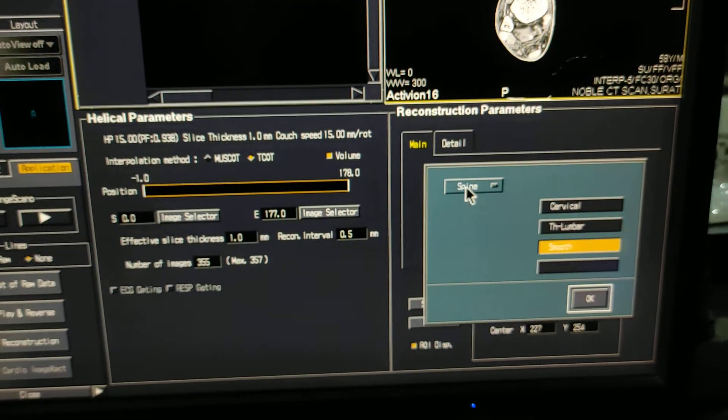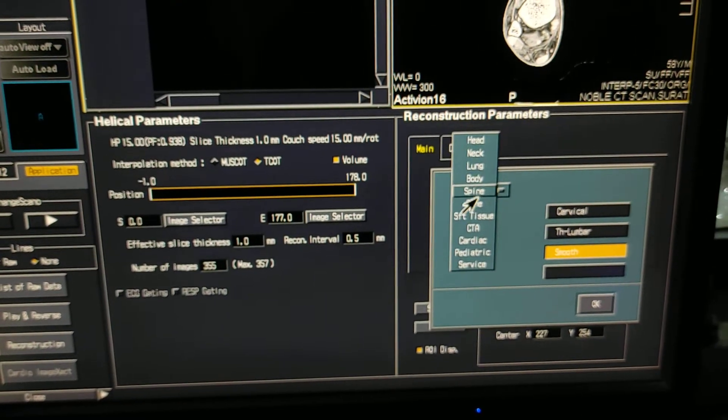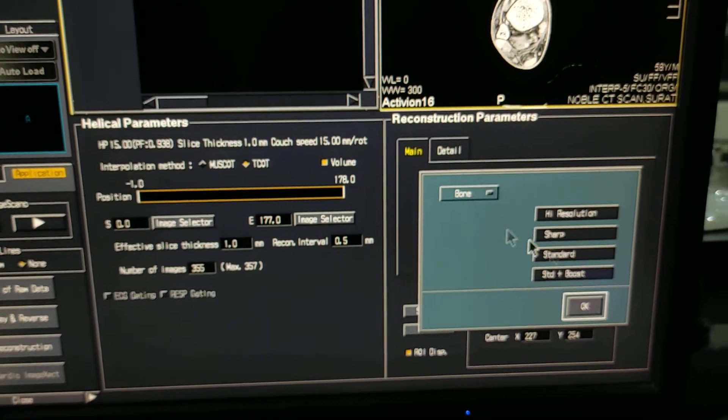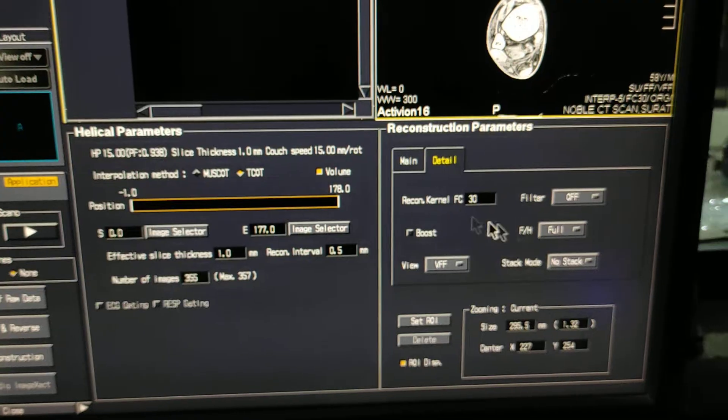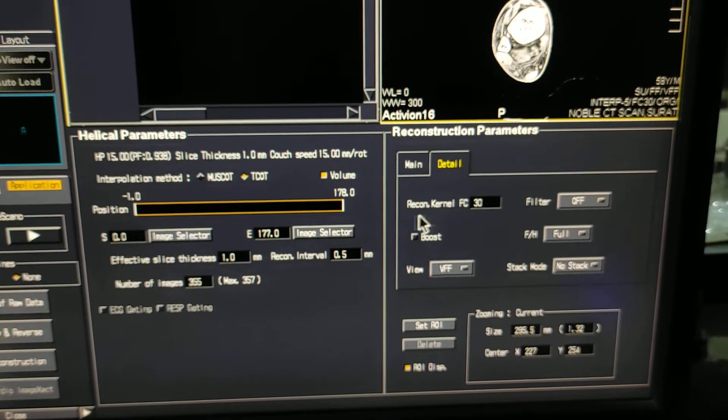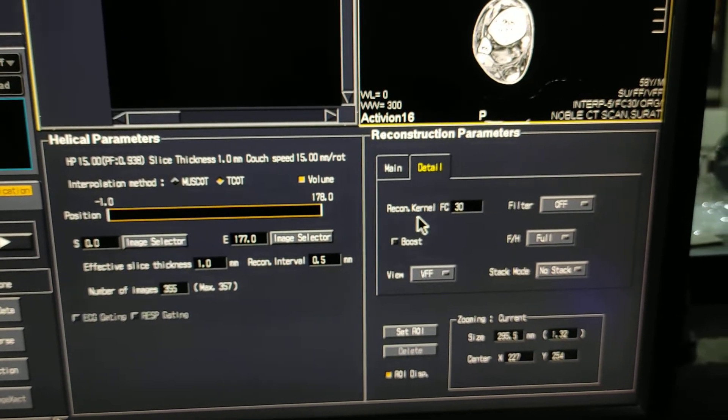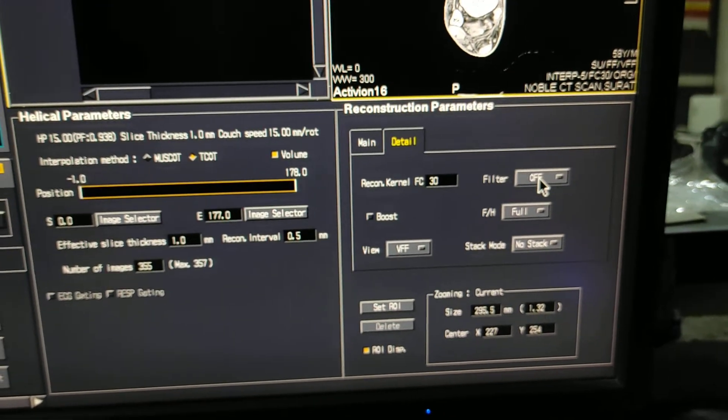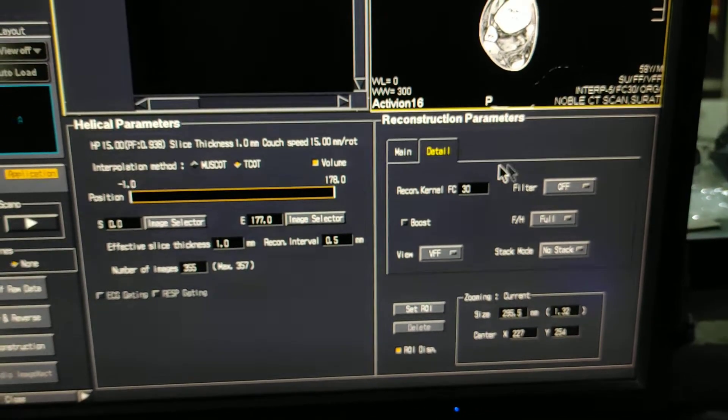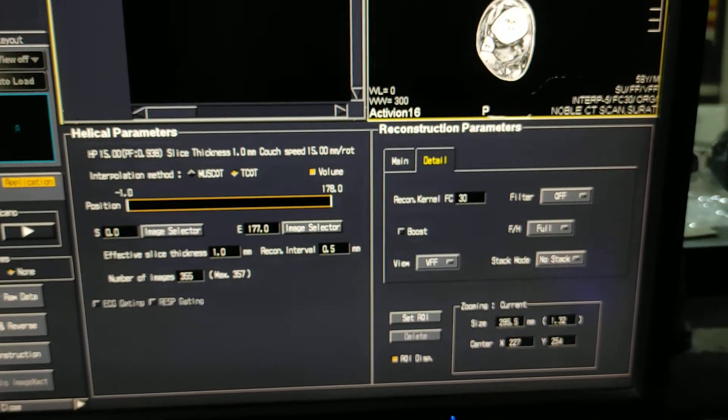And for sharp bone, select bone standard, details. Recon coronal FC30, and filter is off. This is for grainy.